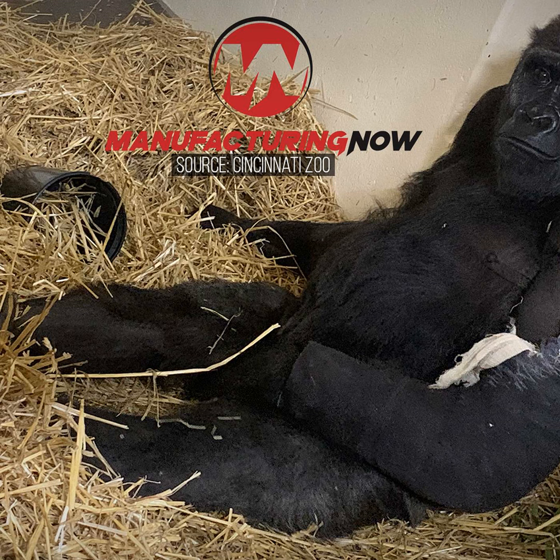If you've ever broken a bone and needed a cast, you know how itchy, sweaty, and generally uncomfortable plaster casts can be. Using a waterproof polymer, the Mayo Clinic is able to print casts that make it easier for wearers to bathe, sweat, and do other things that are much more difficult with a traditional cast.